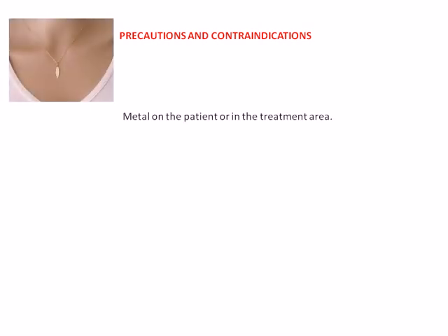In addition to the general precautions and contraindications to heat, any metal on the patient or in the immediate treatment area should be removed. Metal's high conductivity may increase burn risk. Necklaces, snaps, zippers, and other metal appliances should be removed from the patient.